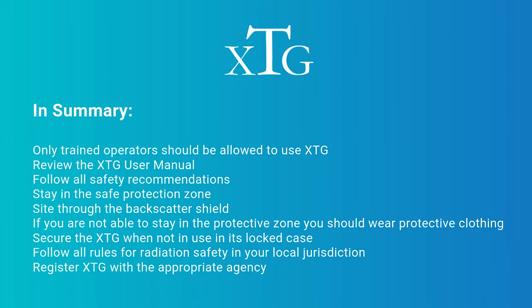In summary, only trained operators should be allowed to use XTG. Review the XTG user manual. Follow all safety recommendations. Stay in the safe protection zone. Sight through the backscatter shield. If you are not able to stay in the protective zone, you should wear protective clothing. Secure the XTG when not in use in its locked case. Follow all rules for radiation safety in your local jurisdiction, and register the XTG with the appropriate agency.